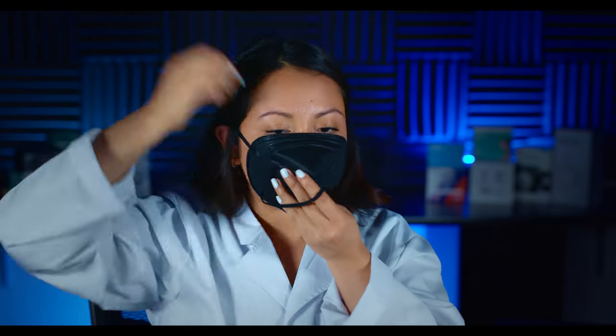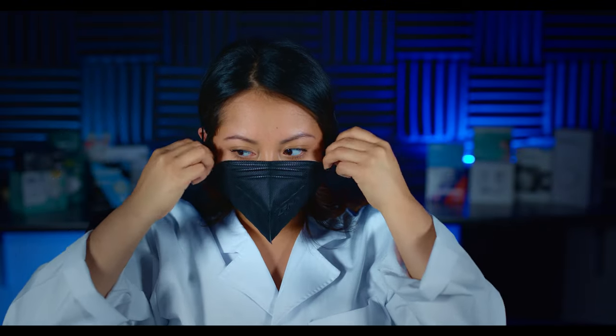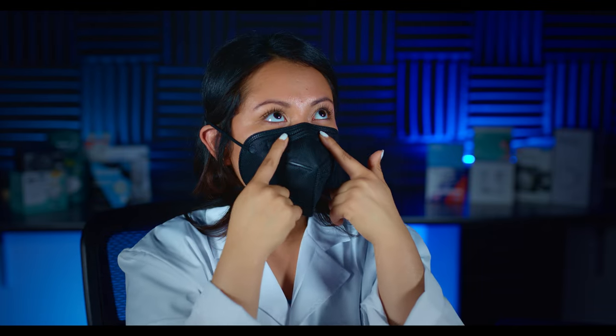Let's go ahead and try this on. I personally like to flatten out the nose wire before I put it on because it helps me have a more natural fit. The first thing I've noticed is that being a five-layer respirator, these are very breathable. They don't seem to have a noticeable smell, which is obviously a good thing. Now that I've adjusted the nose wire I do feel like I am getting a perfect seal, and although this doesn't have nose foam I definitely feel like I'm getting a good seal.